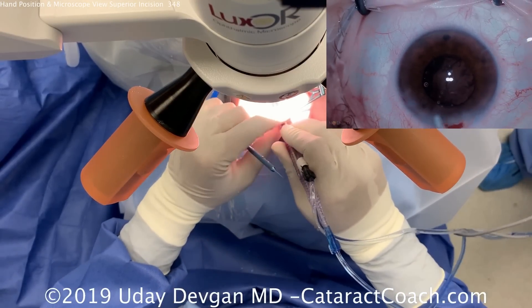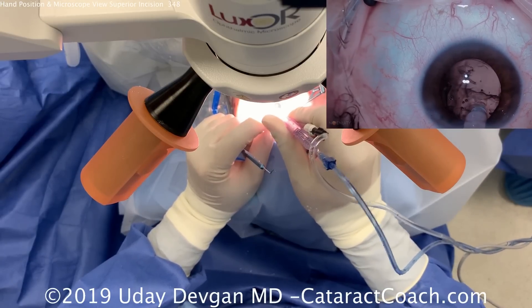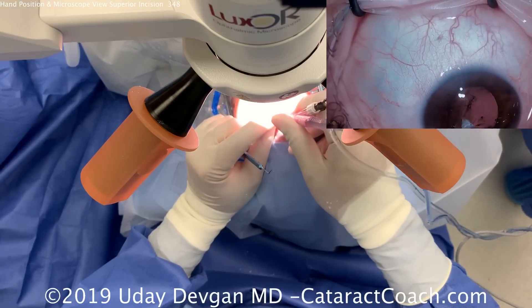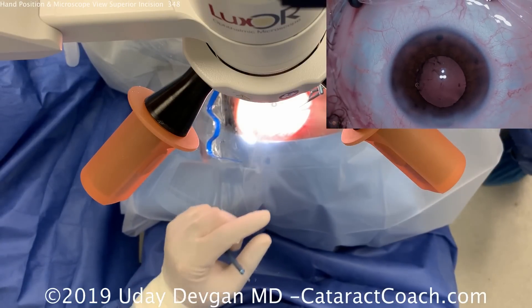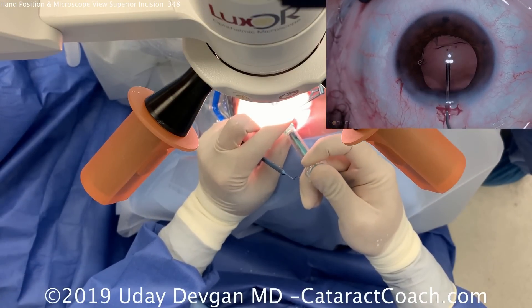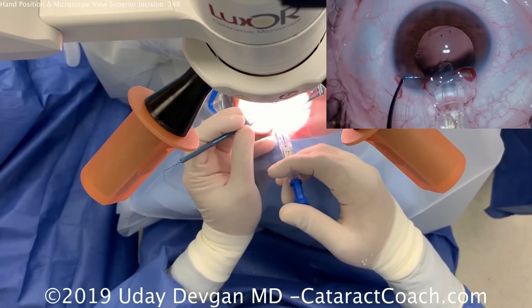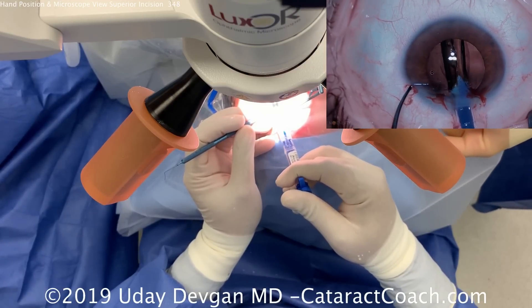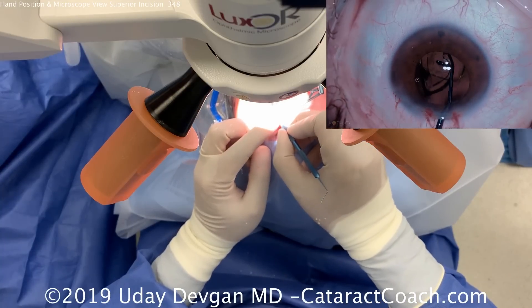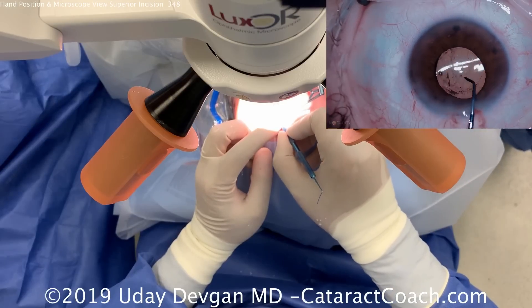The I/A probe goes inside to remove the cortex, while the technician also untangles the FACO probe. At this point the technician is loading up our IOL. In the left hand, I have the chopper and spatula in order to use them if needed, such as to push in a piece of epinucleus. The capsule bag looks clean, so we put in cohesive viscoelastic — any residual material in the anterior chamber will be removed at the end. Here comes the IOL. The chopper is now used to fixate the eye via the paracentesis while the right hand delivers the lens by holding the plunger. If right-hand dominant, you can switch the chopper to the right hand to position the lens and ensure both haptics open and unfold completely.